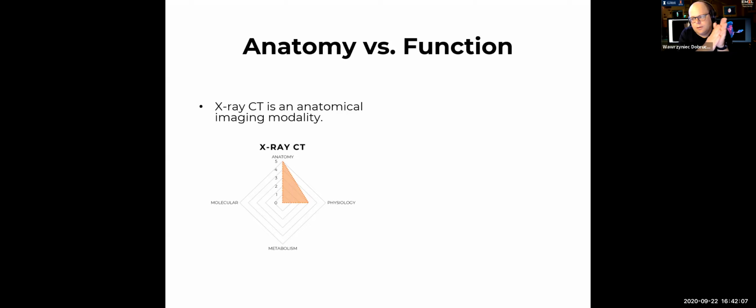Because we are starting to talk about PET imaging, where PET is better than the other modalities: we just finished talking about X-ray CT, which is considered an anatomical imaging modality. It's very good to image anatomy, and changes in anatomy, such as movement or growth of something, like tumor growth.